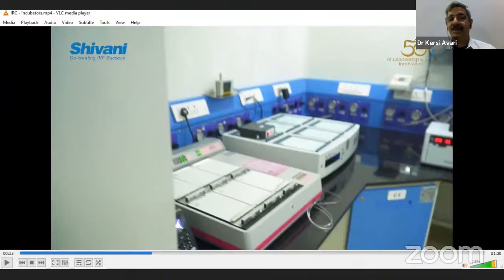importance of the culture system. Now, remember, it is this carbon dioxide which will be completely occupying your incubator, which is responsible for modulating the pH of your media, which is equilibrating your media. So this is an environment which is created in the incubator. So what is an incubator? It is your glorified uterus.